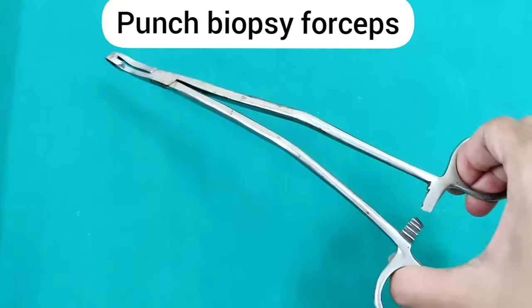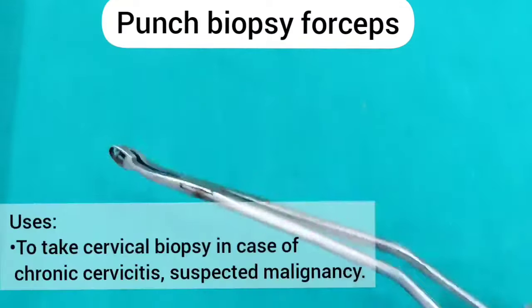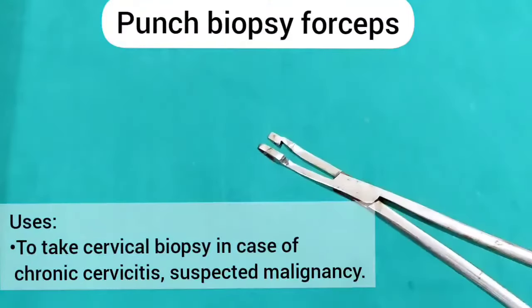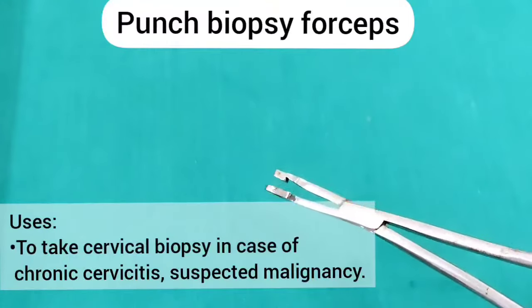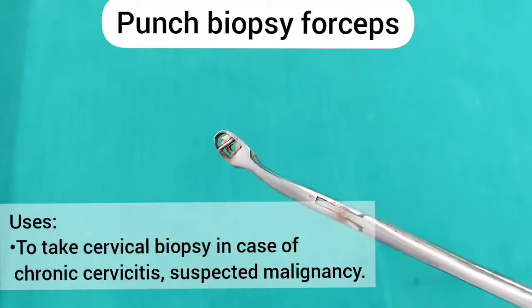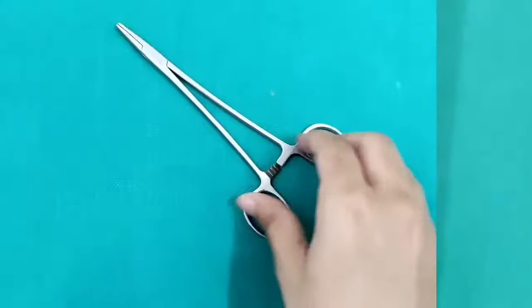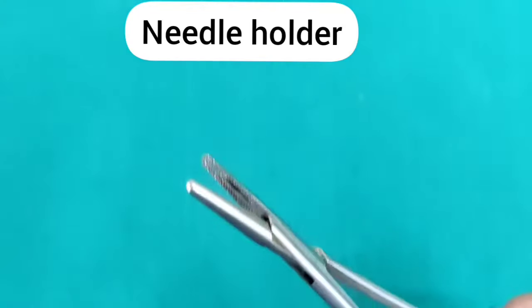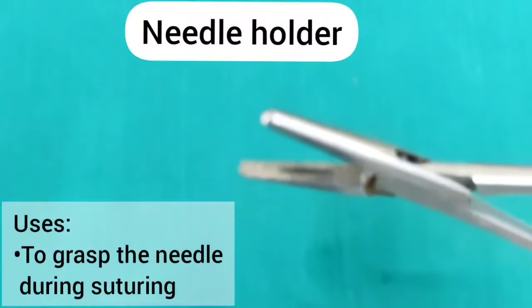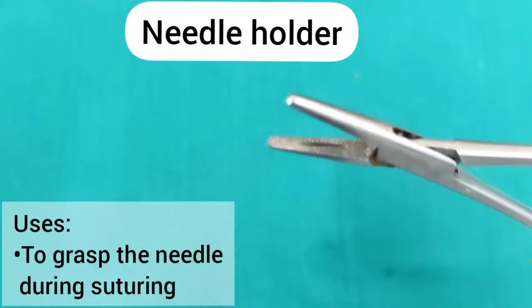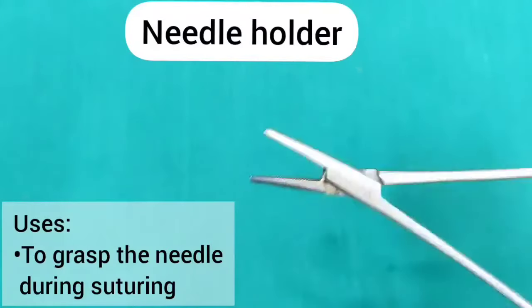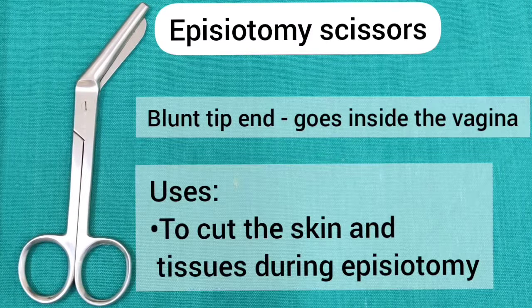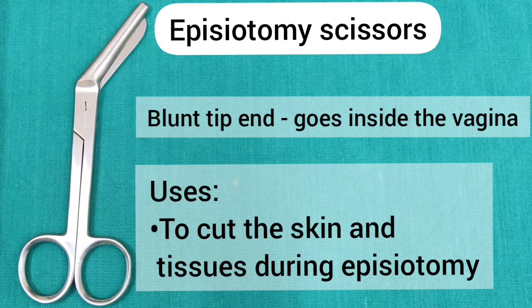This is a punch biopsy forceps, which is used to take cervical biopsy in case of chronic cervicitis or suspected malignancy. Needle holder — it is used to grasp the needle during suturing. An episiotomy scissor is used to cut the skin and tissues during episiotomy; the blunt tip goes inside the vagina.